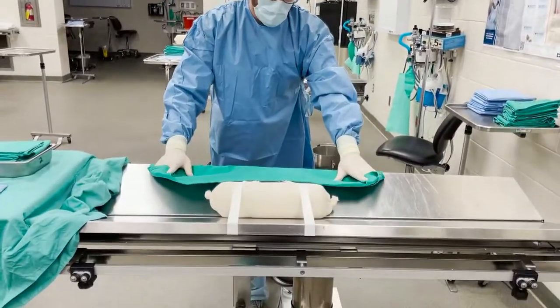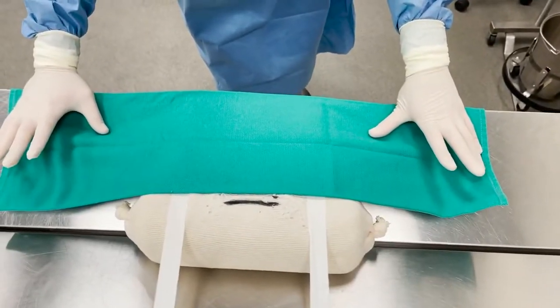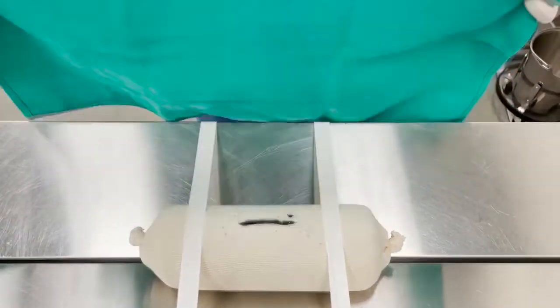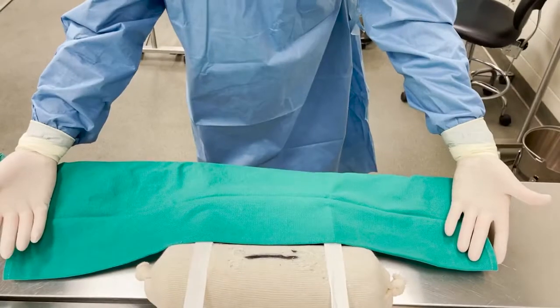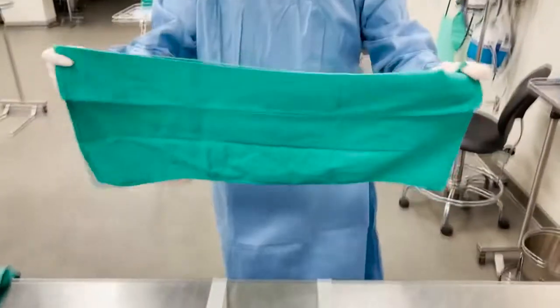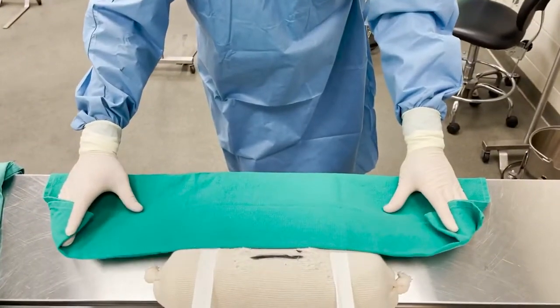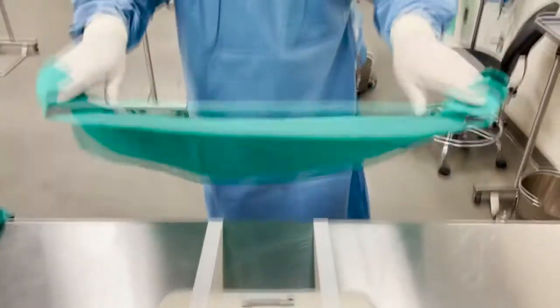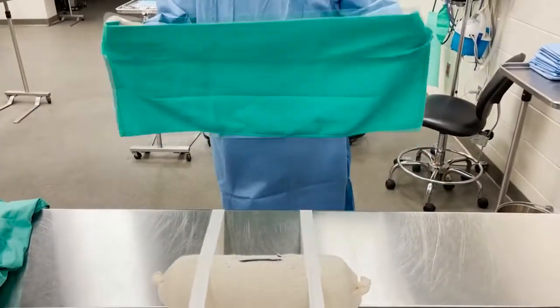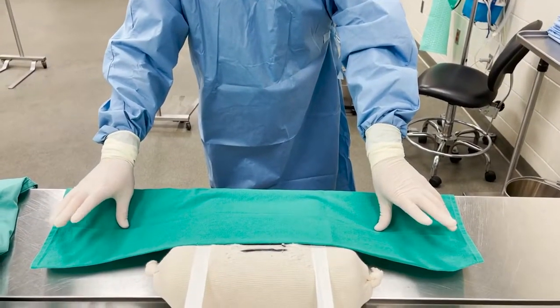I plant my thumbs and then just let go with my fingers, sprinkling out those edges. One mistake people make is they think to roll hands in, roll hands out — you don't want to do that; you're breaking sterility. You just place it and let it go. Don't tinker with it — it's not worth breaking sterility. You don't want to just throw and drop it; you want to place it down controlled, with your fingers covered, so you can place it safely.